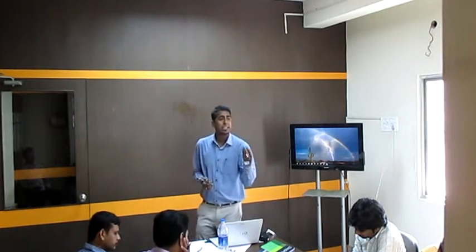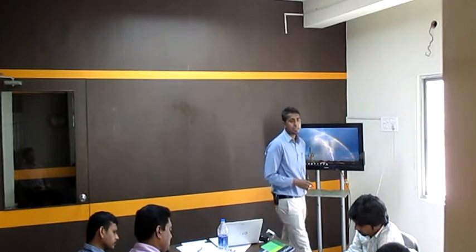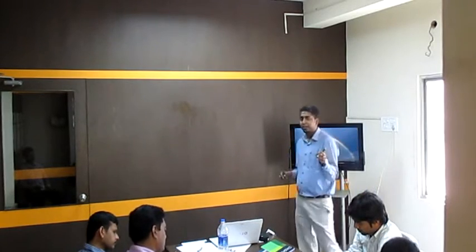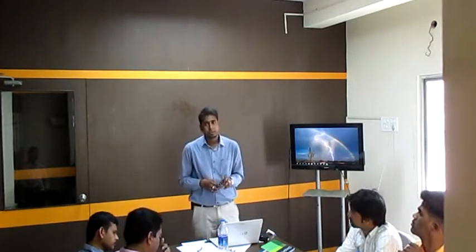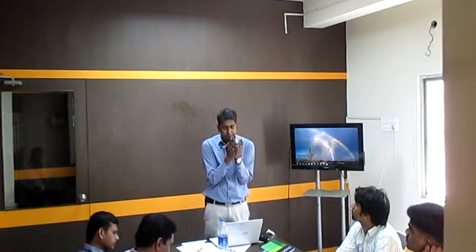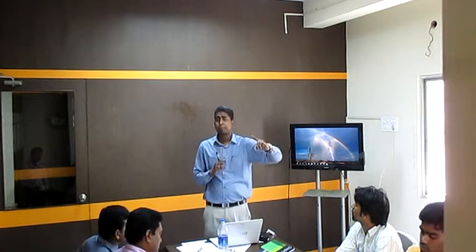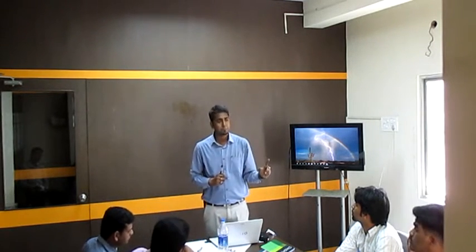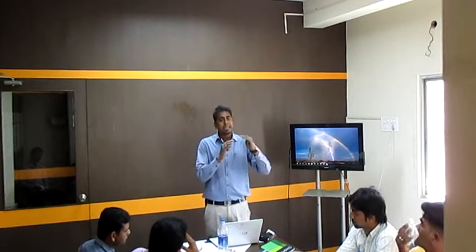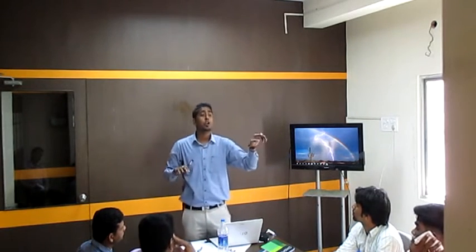Rate of cutting? The speed of cutting, basically. Rate of cutting is proportional with your speed. Higher the speed, higher the rate of cutting. Okay, I am not saying just mind my words. I am not saying rate of cutting is directly proportional with speed. I am saying it's proportional. It's proportional means increase in the speed will increase the cutting, but not in a direct proportion.